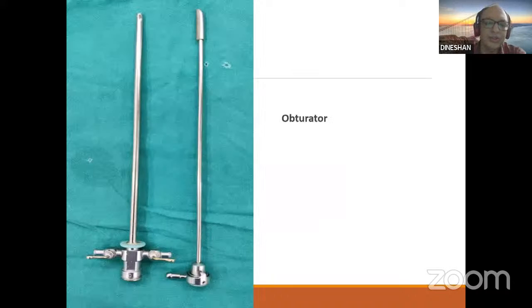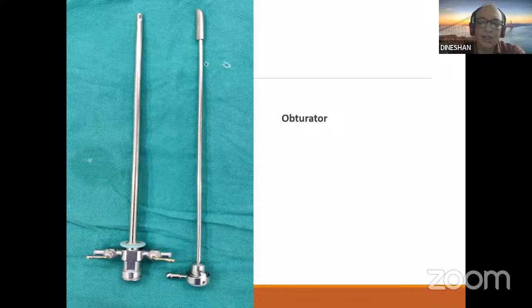And now coming to the obturator, you have different types of obturators here. All the obturators are color coded according to the sheath. The same color code used for the sheath is used for the obturator also, so it is very easy to identify which corresponds to which.